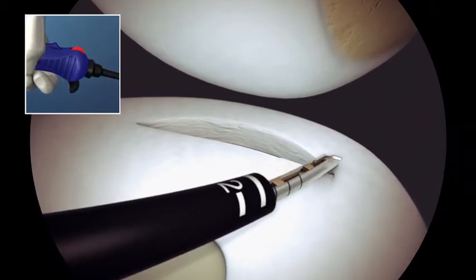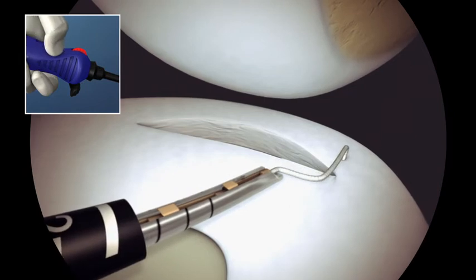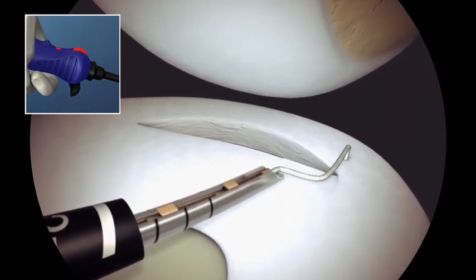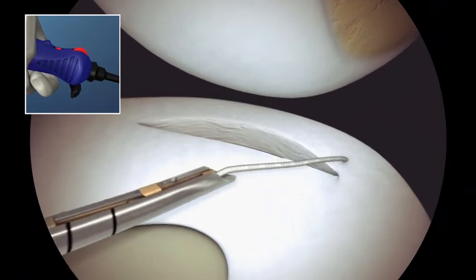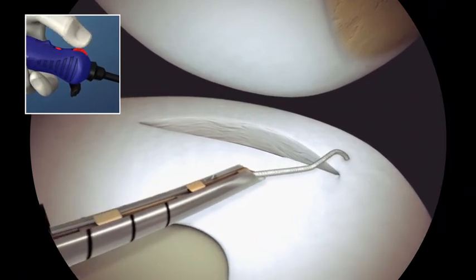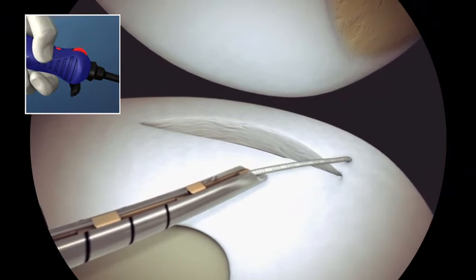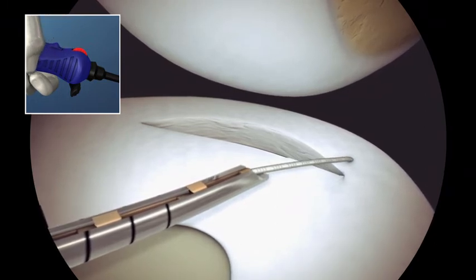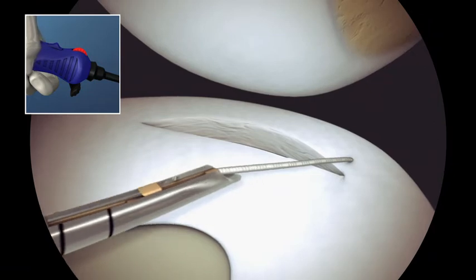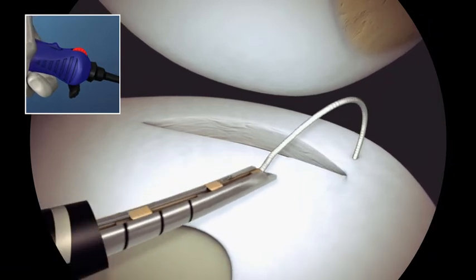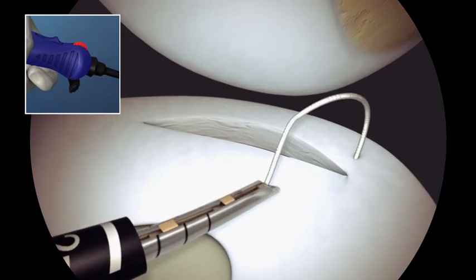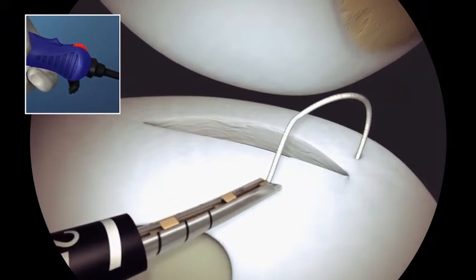Move the switch backwards to the ratchet position to tension the suture. The red dot should be exposed. Pull back on the device and reel the thumb wheel to tension the suture and ensure that the implant is set. Move the switch forward into the freewheel position to create slack in the suture. Target the position of the next implant on the meniscus.